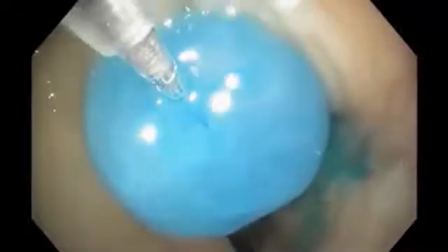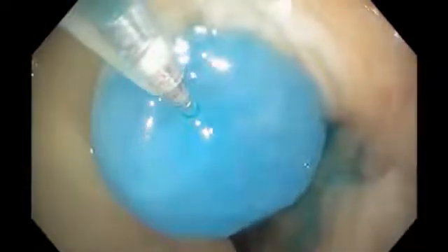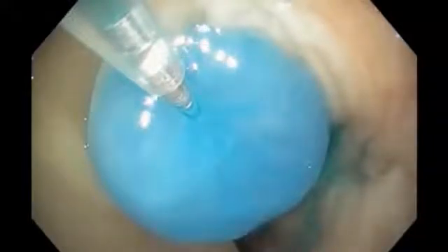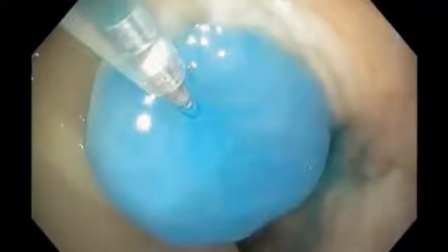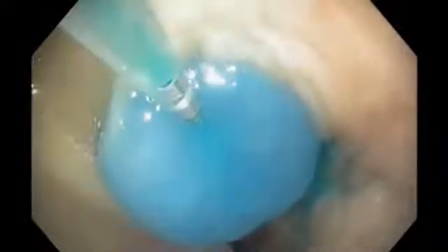And now the optimal position of the scope is going to be to start to move away from that submucosal mound so that we can see it developing. We want to see the lesion appear on the top of that submucosal injection mound.